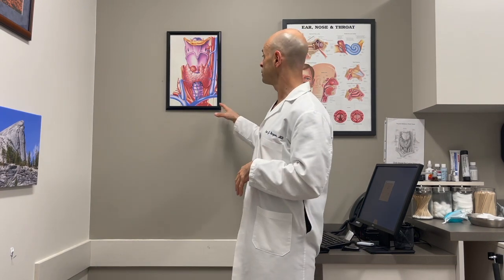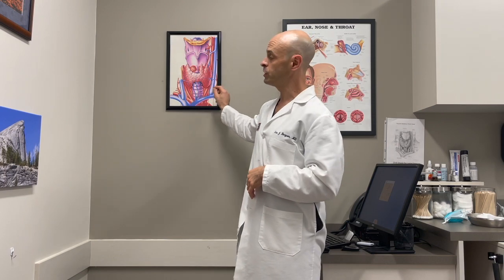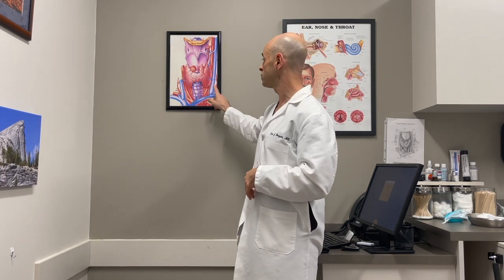And that tells you that the whole neural circuit is working properly. So you can use the nerve monitor to, we call it, map the nerve. In other words, before you visually identify it, you can use the probe to simply touch a few areas, and if you get a beep, it gives you a hint that that's the area where the nerve is.